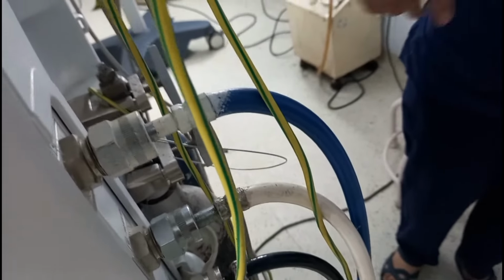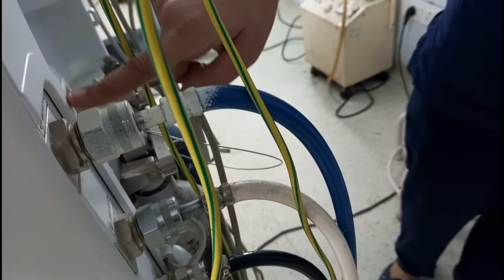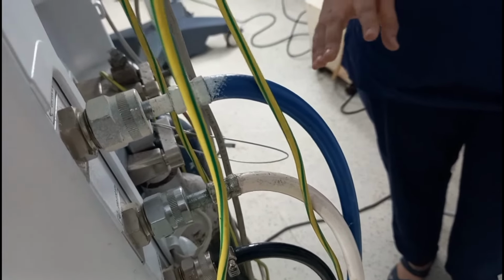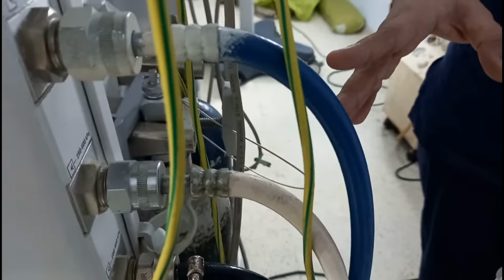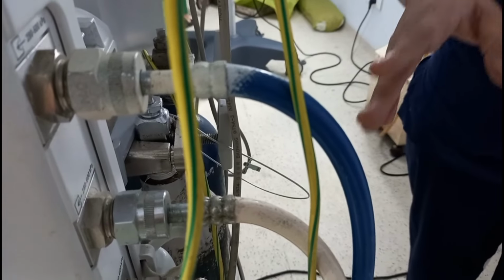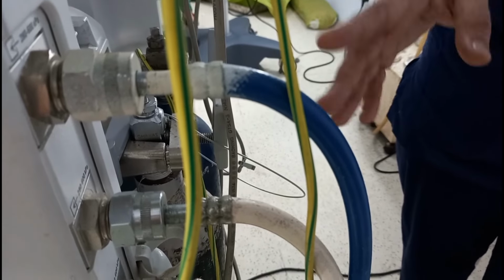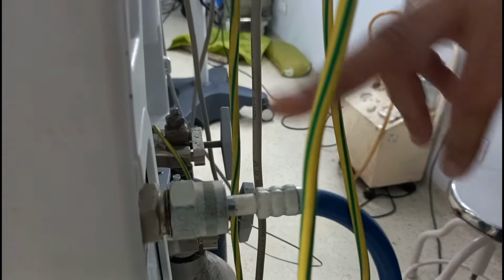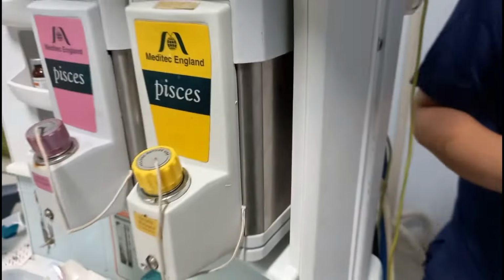So this color coding of the pipeline, this pipeline comes out here. As I had already told you, this pipeline pressure comes in the intermediate pressure system. So this is the part of intermediate pressure system where the pipelines are at a PSIG of 45 to 50 PSIG. So this is the part of high pressure system. This is the intermediate pressure system which we can see. And coming on to the last, low pressure system.